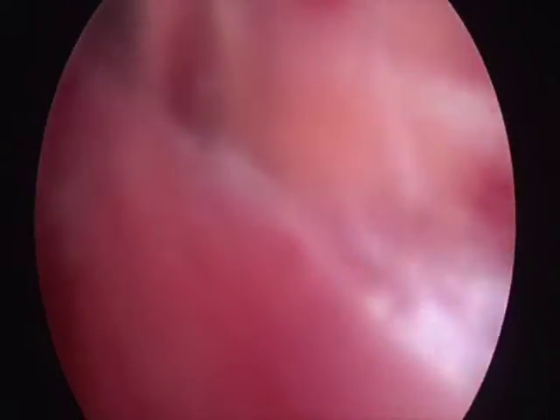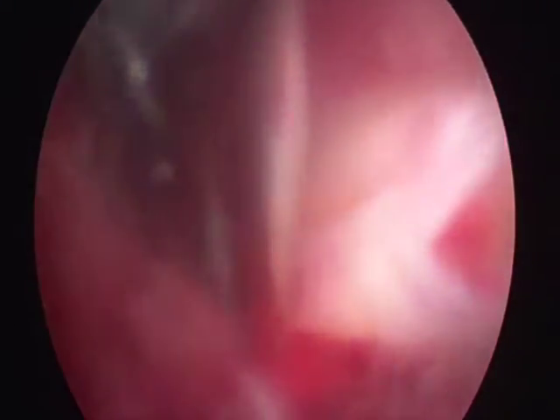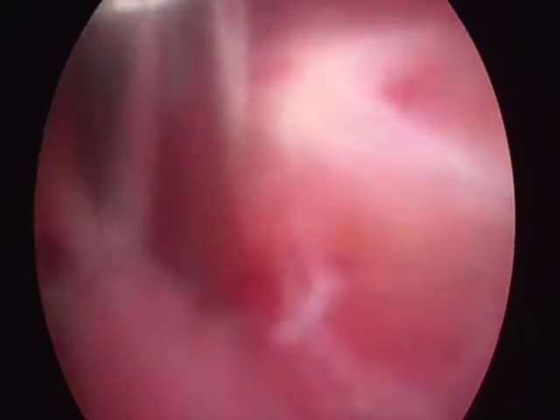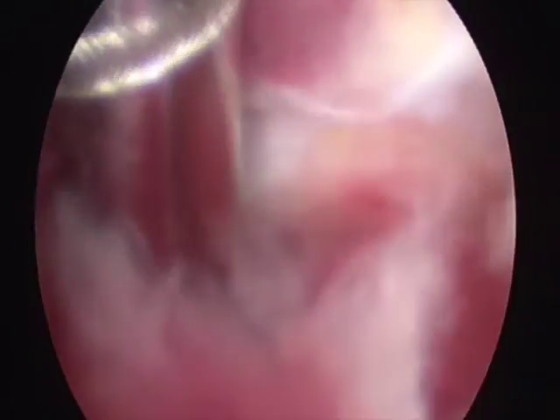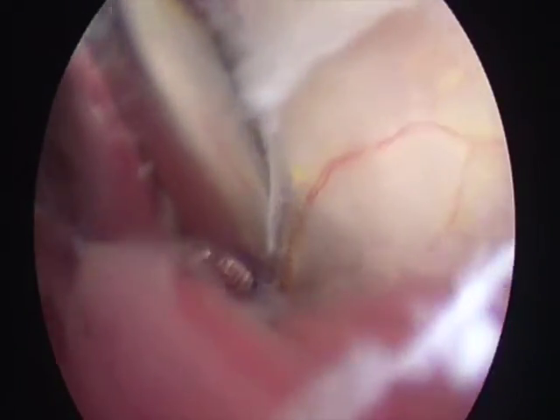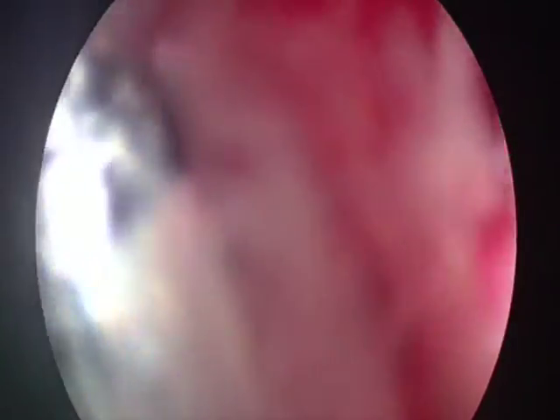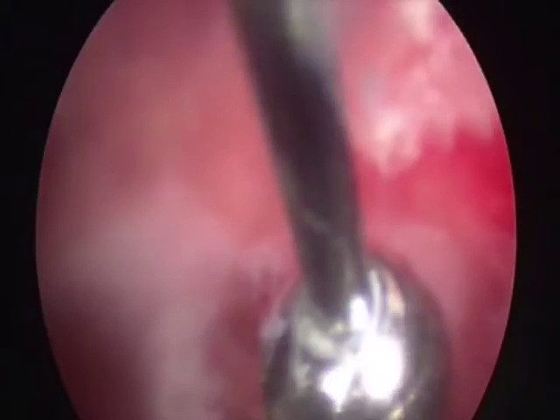Fibrous bands around the sciatic nerve are dissected and resected using a shaver. Note how careful dissection is performed around the sciatic nerve for a complete release. As the release of the fibrous tissue progresses, the nerve is decompressed and the vasa nervorum becomes more apparent. Once the release is complete, a nerve stimulator is used to verify nerve conduction.